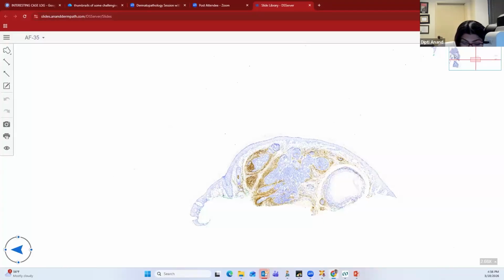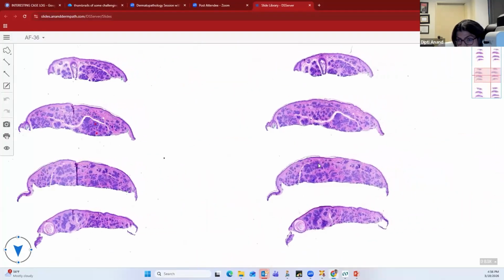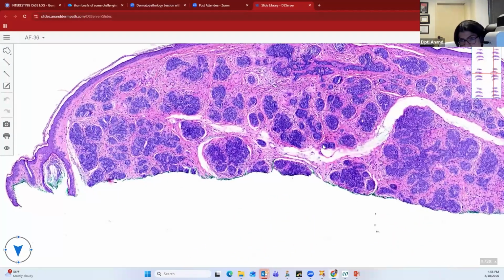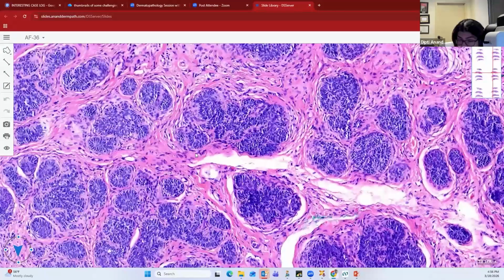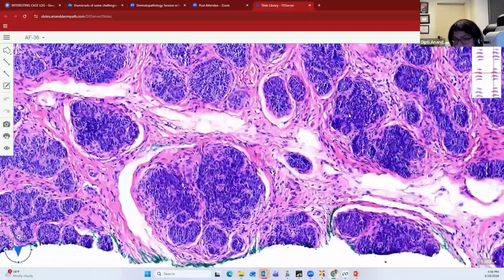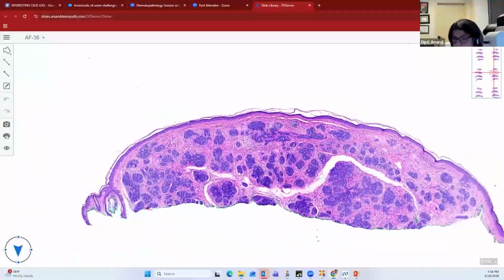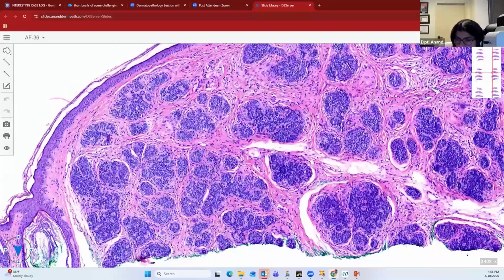So that's your trichoepithelioma. The extreme end of the spectrum is your trichoblastoma. Trichoblastomas can be large, big lesions. Clinically, they often make you think about a basal cell, but you can see histologically there are barely any horn cysts, very few horn cysts, or none. And then you have all these immature follicular epithelial islands, which look exactly like those of a trichoepithelioma. So you can see papillary mesenchymal bodies, you can see these immature hair follicles. And again, you see the stroma, which is an important component of the lesion, and stroma to stroma retraction can also be seen. So you can see the nice pink stroma.